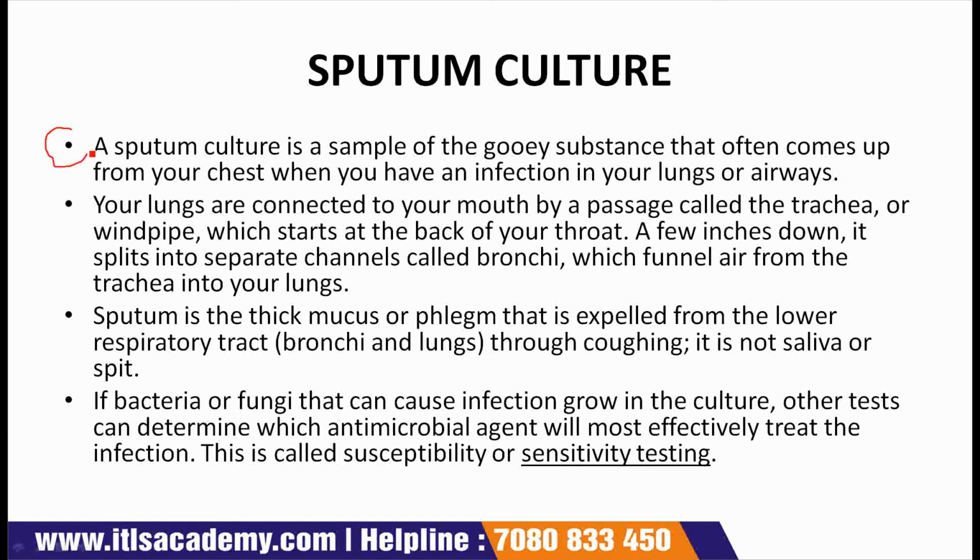First point is a sputum culture is a sample of the gooey substance that often comes up from your chest when you have an infection in your lungs or airways. Doctors use it to figure out what might be causing your illness, whether it is bacteria, a virus, or something else.